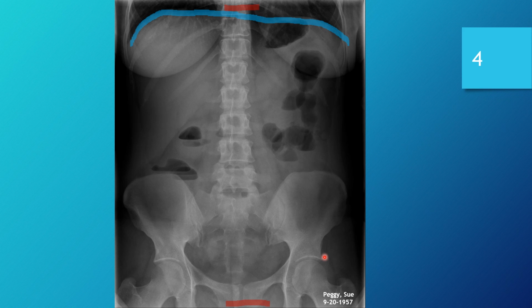This one's good. This one's really good because it has the whole belly in it. So yeah, as far as anatomy goes, this one's excellent. All the anatomy is present. Really good on that aspect of things. Moving on, is it properly positioned?